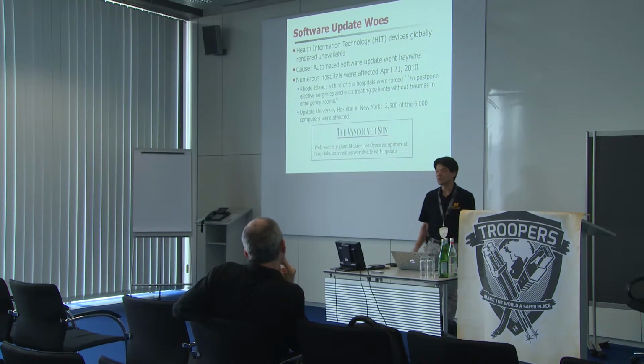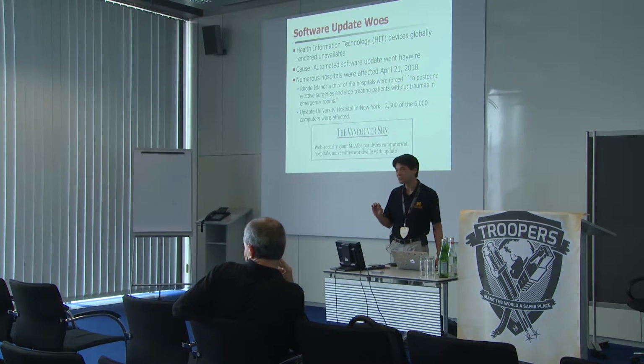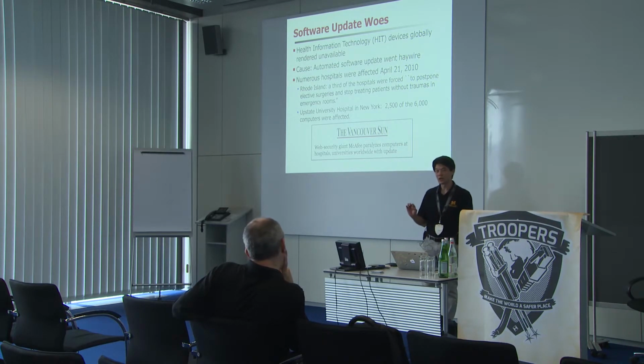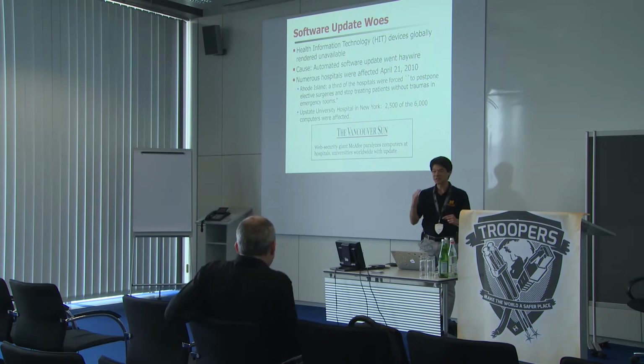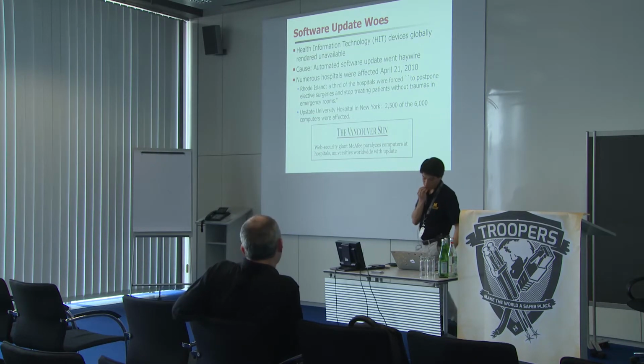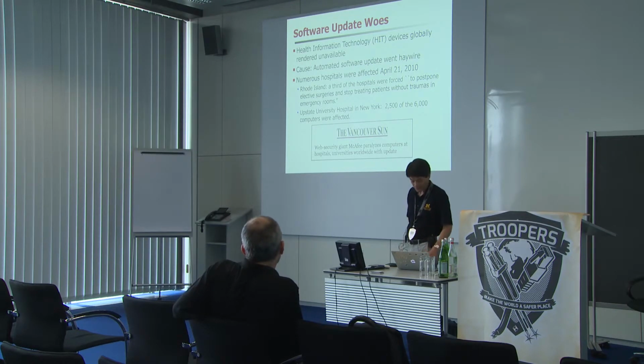So this actually happens in hospitals. Some of the problems are, you would be amazed what clinicians have to deal with. I recently saw a picture from a hospital of a Kerberos authentication login system for the electronic health records, where it was so poorly designed from a user interface perspective, the clinicians actually put a piece of tape up on the monitor with a big X through it saying, "Don't click here." Literally, it's a piece of tape. You know the old joke about putting whiteout on the screen? They actually did this because the user interfaces are so bad. But anyhow, in this case, in some hospitals, they stopped admitting patients, except for those with severe issues like gunshot wounds, because the system wouldn't work.